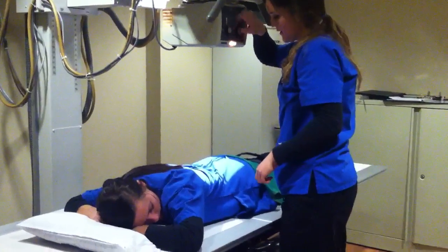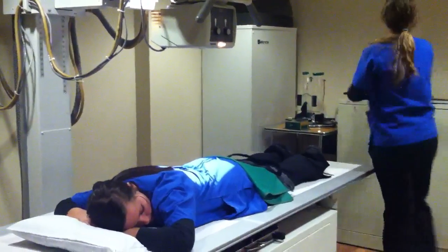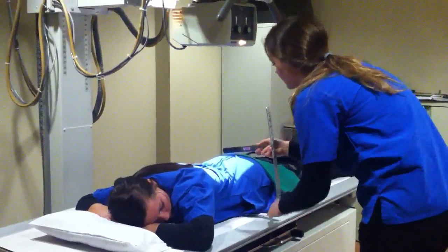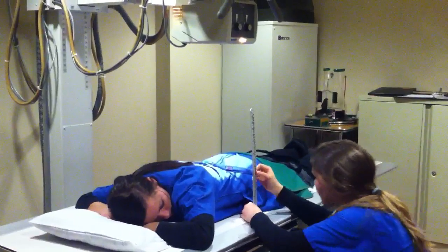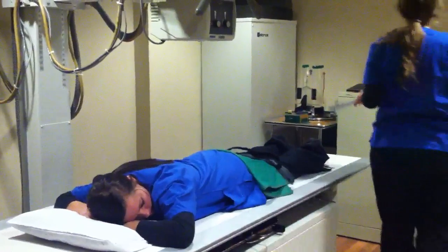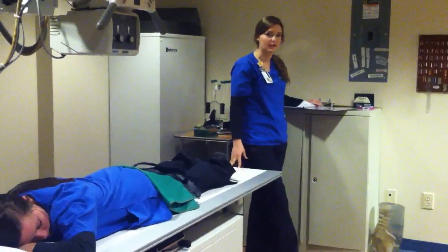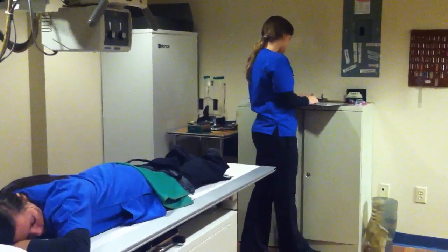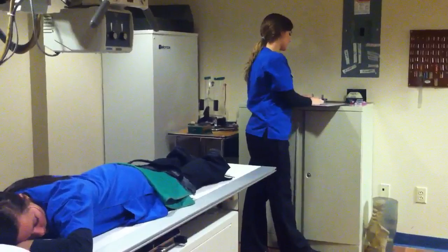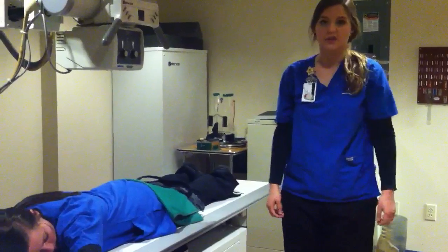You can collimate a little bit side to side if you have a thinner patient. You want to measure through the path of the central ray. So I have 17 centimeters here. Barium attenuates more of the beam than regular tissue, so your exposure is going to have to be increased. So for 17 centimeters, I'm going to use 101 kVp at 5 mAs with a large focal spot. And I'll have her double breathe, and I'll take the exposure on suspended expiration.